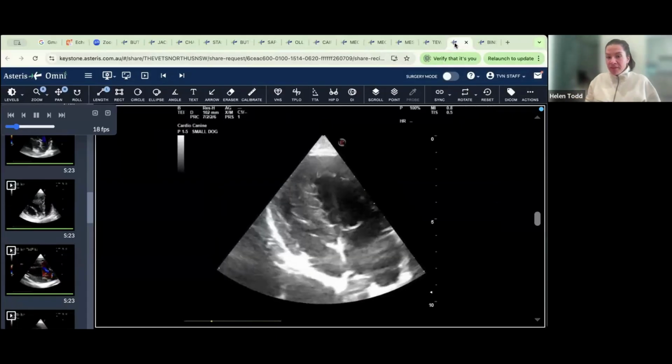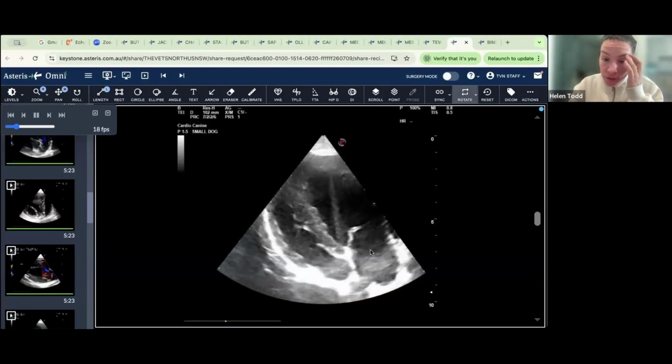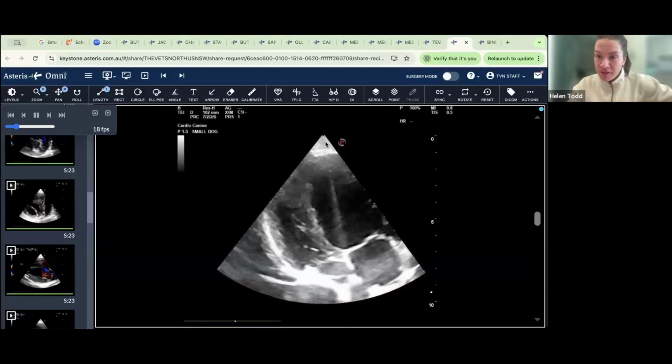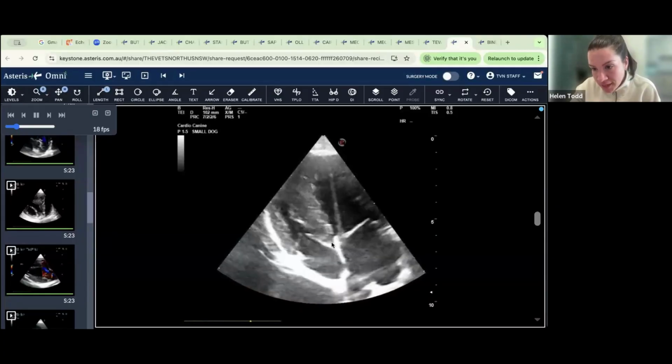So now we're flipping. This image is now with the patient in left lateral. So we've rolled over, and we call this a left apical view. Closest to the probe here is down at the ventricle. So I'm a little bit further caudal in the chest, and we're looking up through the heart. So from this view, we're going to expect our aorta and our left ventricular outflow tract, Carly, to come in here where I'm circling.